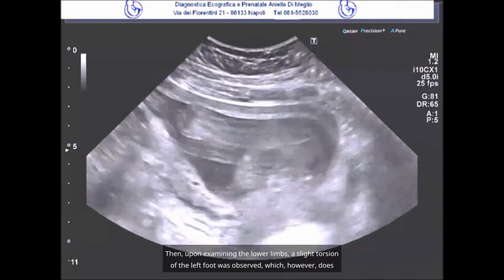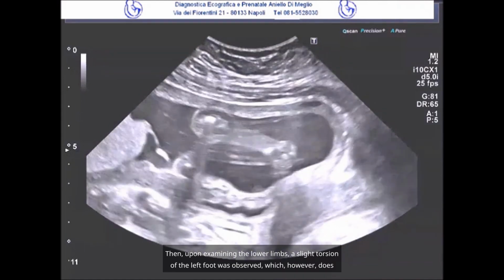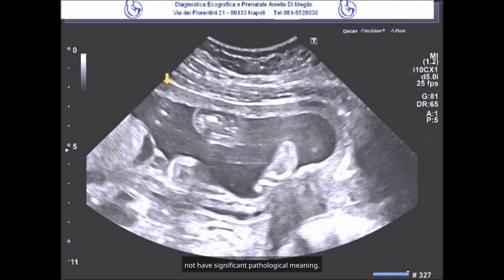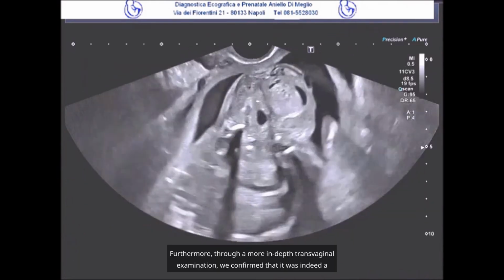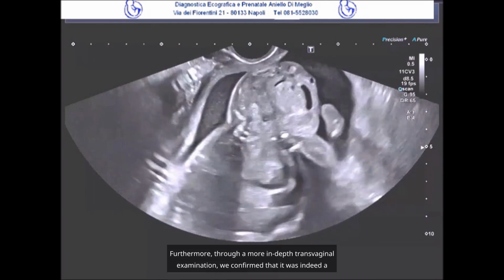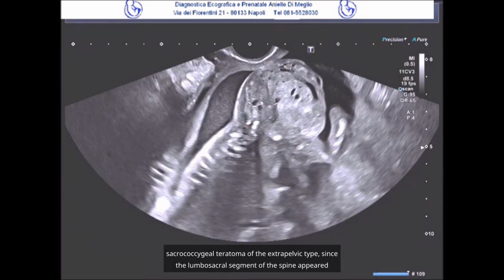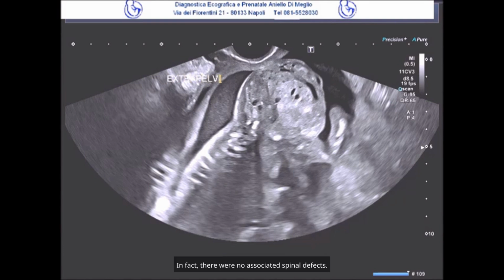Then, upon examining the lower limbs, a slight torsion of the left foot was observed, which, however, does not have significant pathological meaning. Furthermore, through a more in-depth transvaginal examination, we confirmed that it was indeed a sacrococcygeal teratoma of the extrapelvic type, since the lumbosacral segment of the spine appeared completely normal. In fact, there were no associated spinal defects.